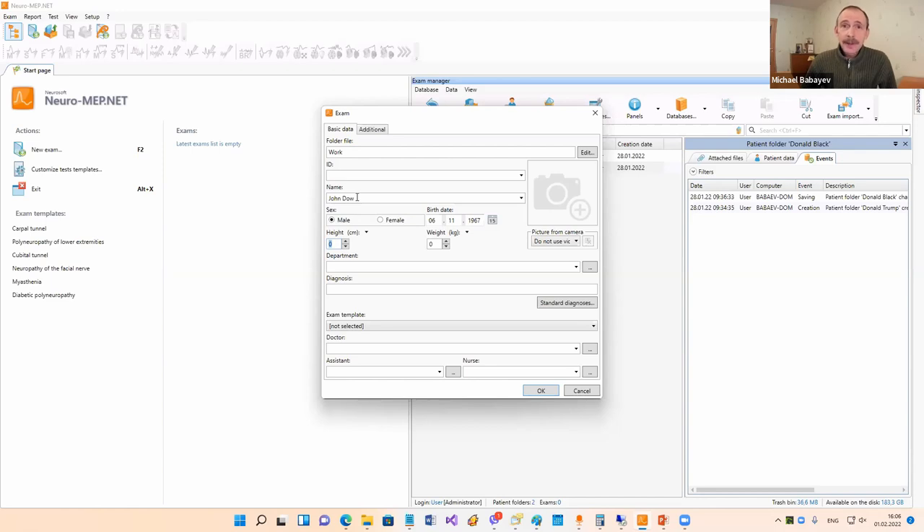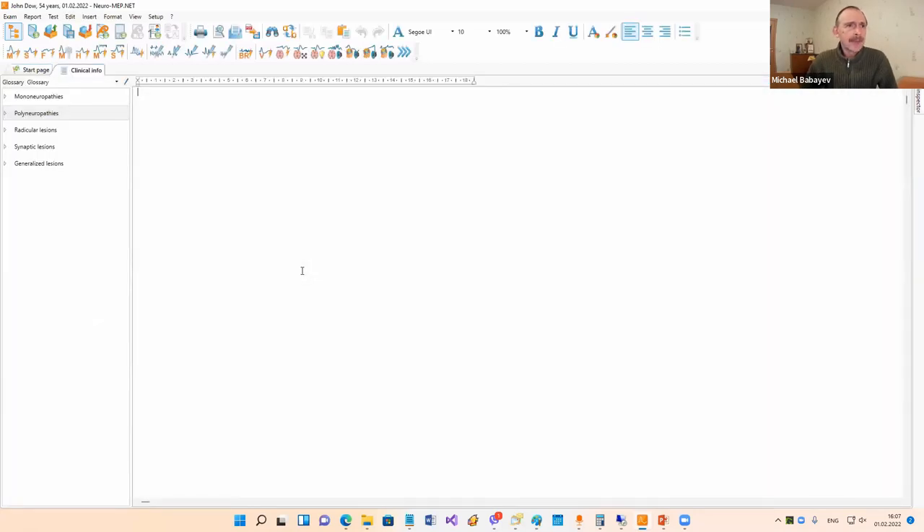Some reference values in the program depend on patient height, so it will be better to input patient height here - for example, it will be useful for F-wave or H-reflex. For example, 178. You can input other fields or not, and then click OK and go to the clinical info window. In this window you can type any information about the disease, patient examination, visual examination, and so on.